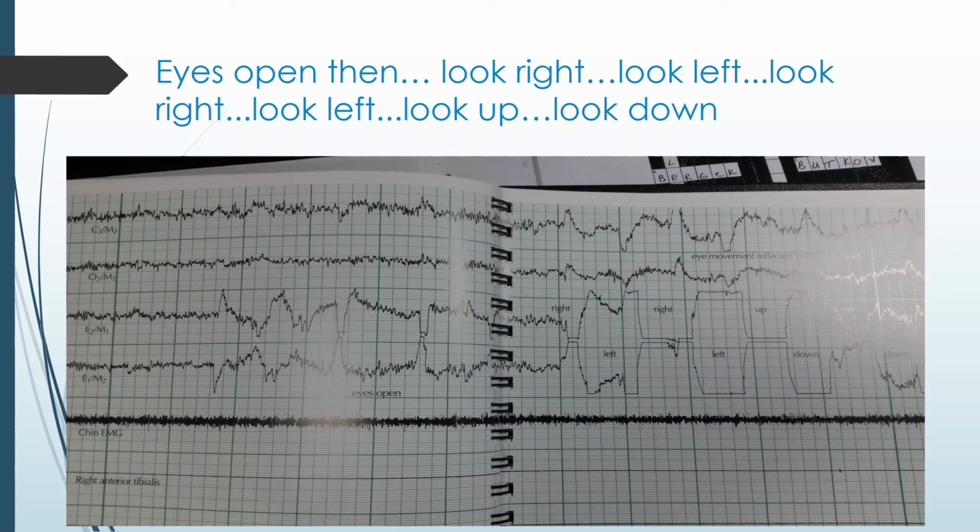Now we're only going to look at the eyes in this picture. So, moving left to right, follow the eyes. You see them start to move, and then you see where it describes the eyes are open. And you can kind of see them blink. Keep moving to your right. And then you see they have instructed the patient to look right and see how the pens deflect.